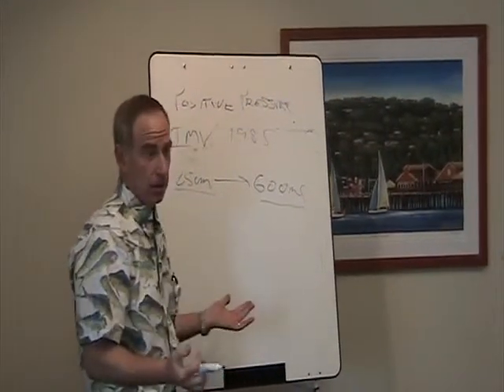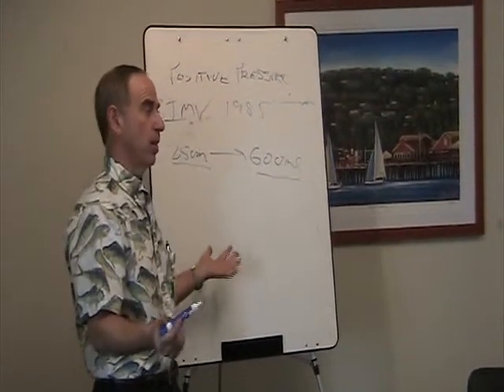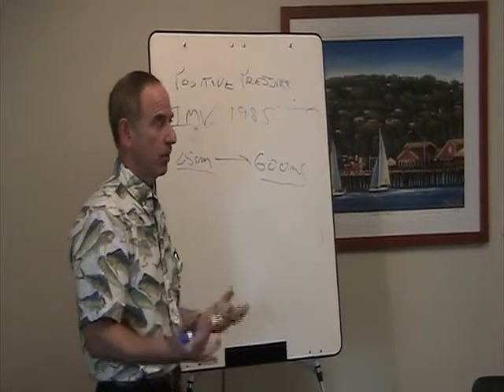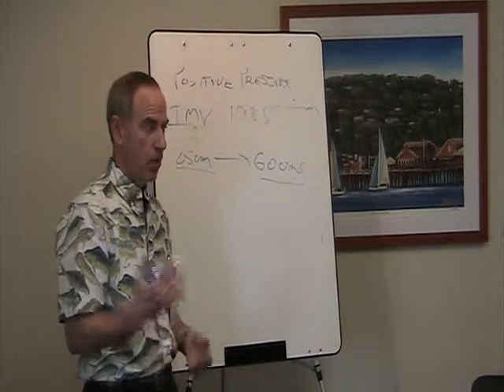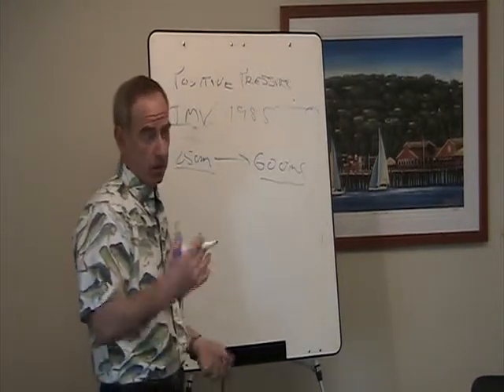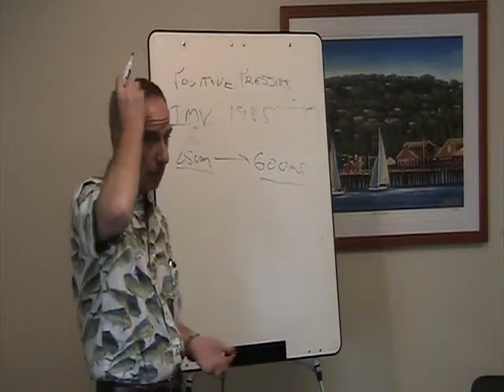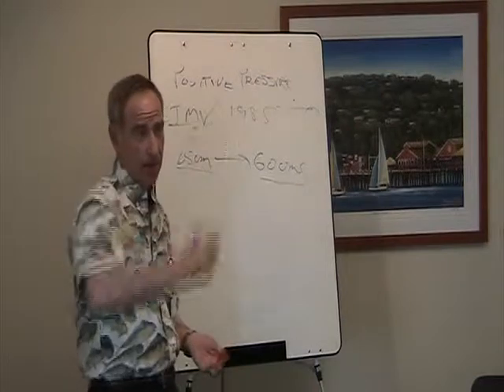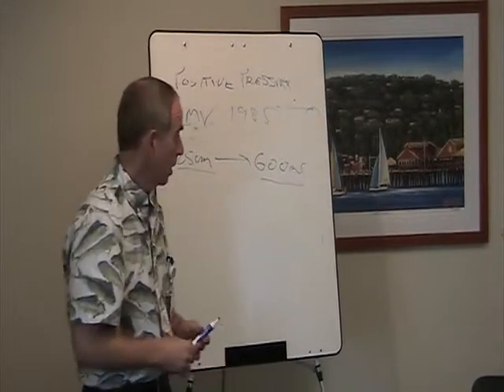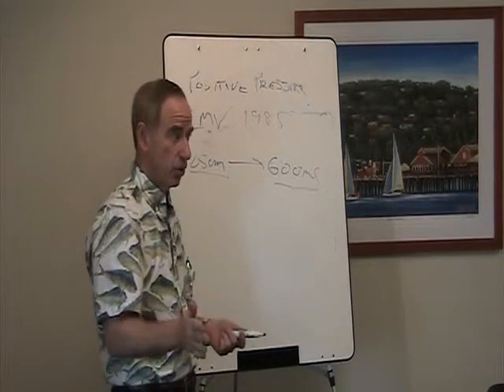But in fact, they're not always equivalent. And that's one of the issues. So when you have somebody who's in volume cycle ventilation, whose pressures are very high, their peak pressures and their plateau pressures are really high, and you're not able to ventilate them adequately, like your patient that you have in 15, one thing that you could consider doing is switching to pressure control.